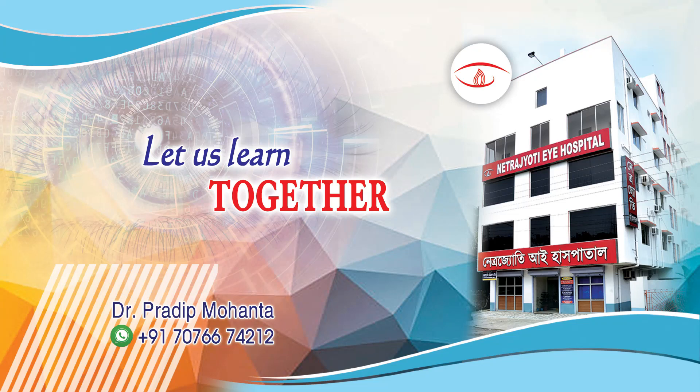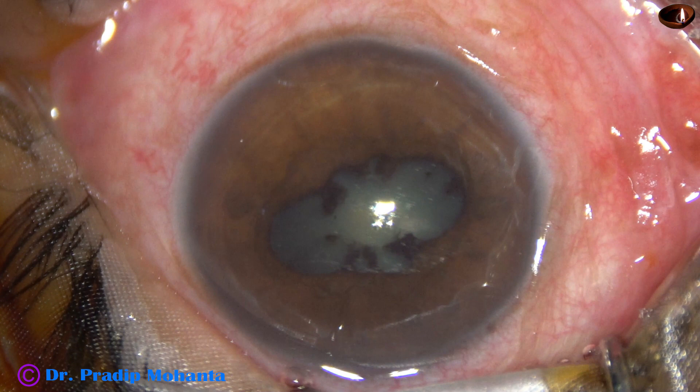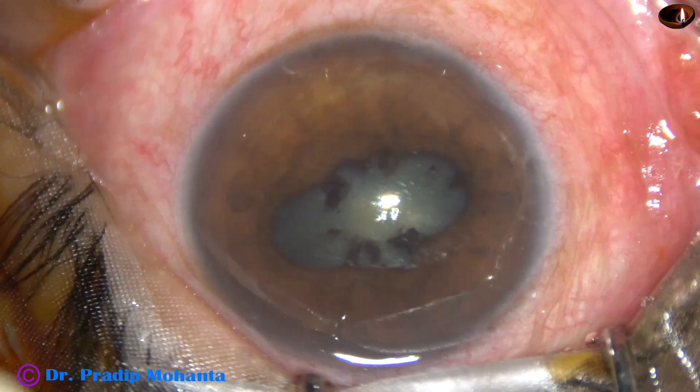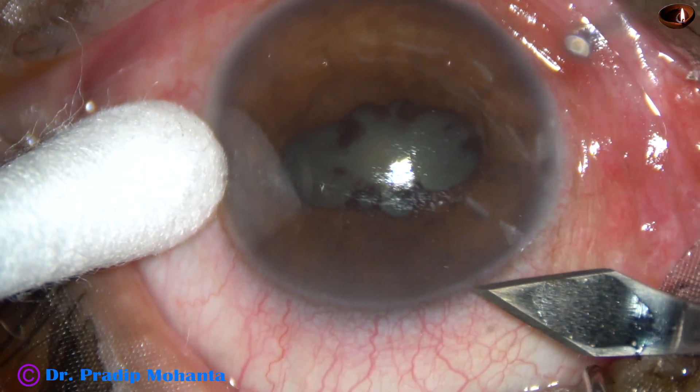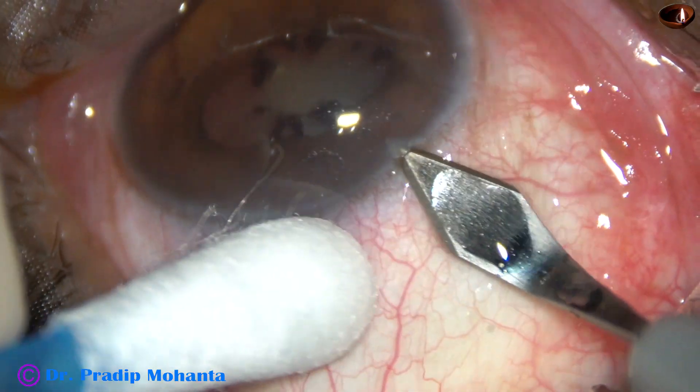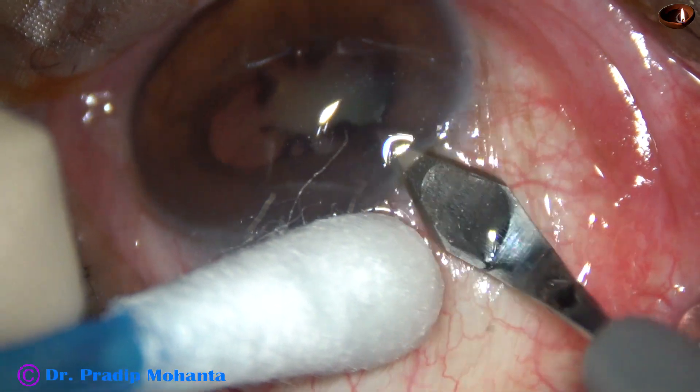Friends, welcome to my workplace at Rana Ghat, West Bengal, India. This is a cataract with posterior synechia. The patient had several attacks of anterior uveitis and there is posterior synechia at several places. I have taken up this case for surgery. Let us observe the surgical steps.